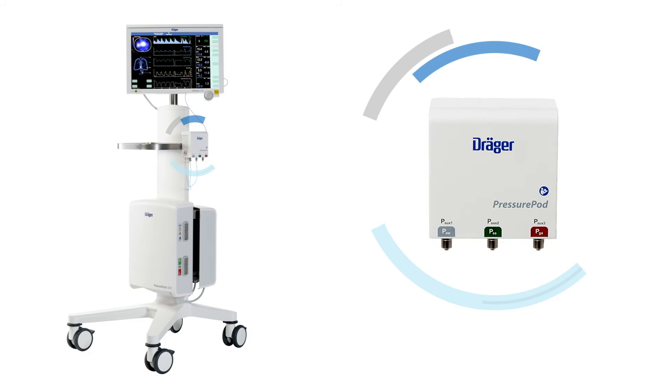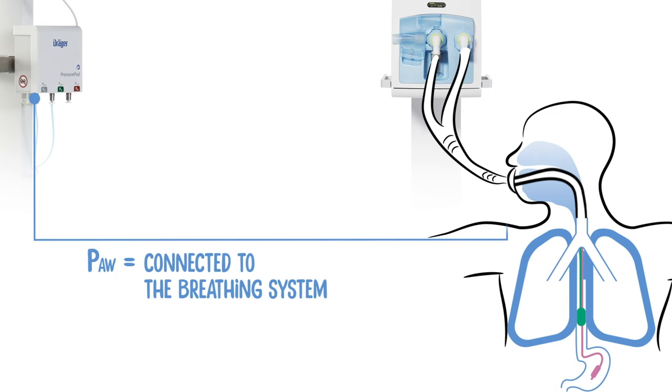With Pulmo Vista and Draeger's new pressure pod you are now able to get all this information. With the Draeger pressure pod you can conveniently measure and analyze airway pressure, esophageal pressure, and gastric pressure.